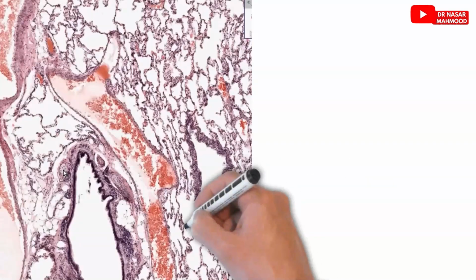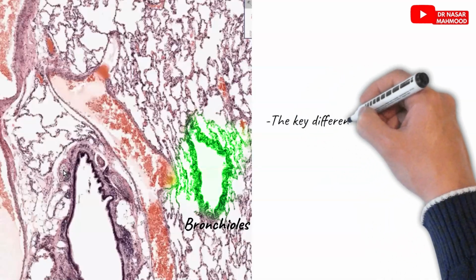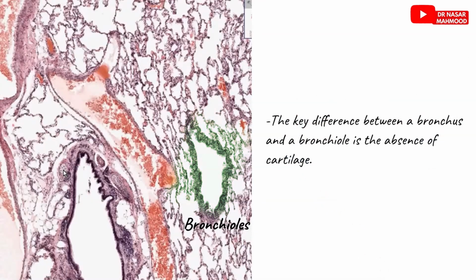As the airways branch further in the lung, they become bronchioles. The key difference between bronchus and bronchiole is the absence of cartilage. Bronchioles are lined by simple columnar or cuboidal epithelium and are surrounded mainly by smooth muscle.